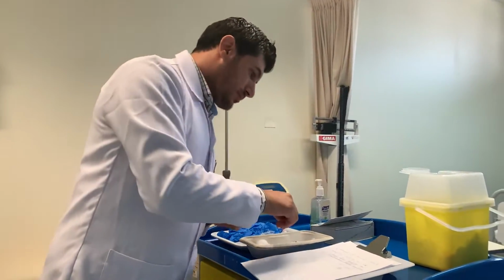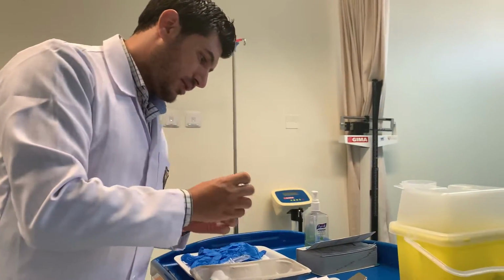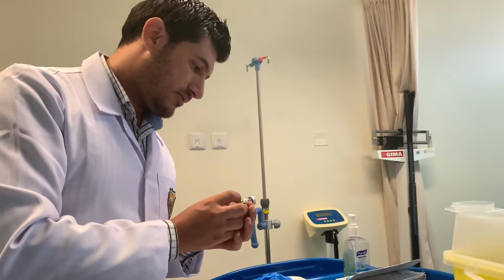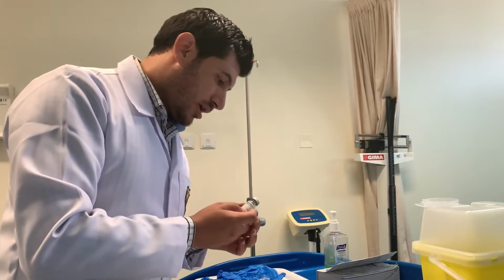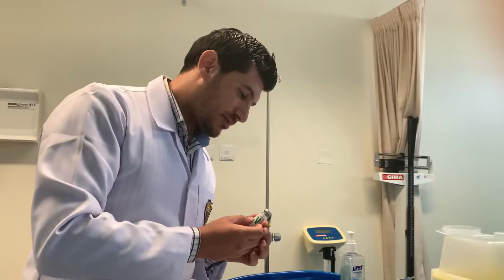So, Mr. Muhammad Saif Hamid, 46225, he has to have a heparin. This is the heparin. Its concentration is 25,000 diluted in 5 ml. So doing the calculation, 5,000 international unit equals 1 ml. We need to see the open date, since this is a multi-use vial.